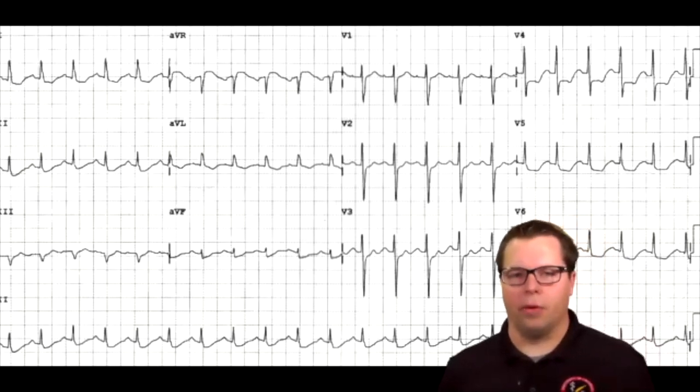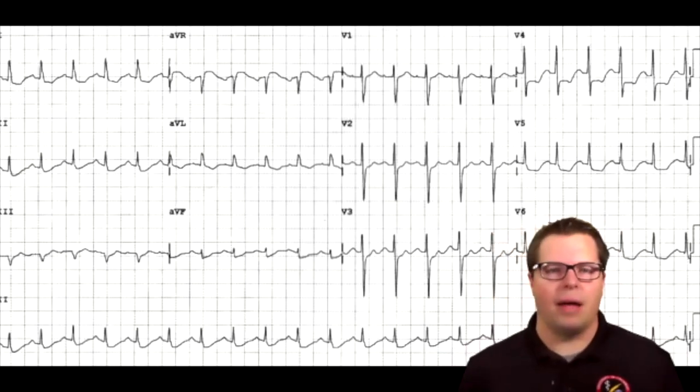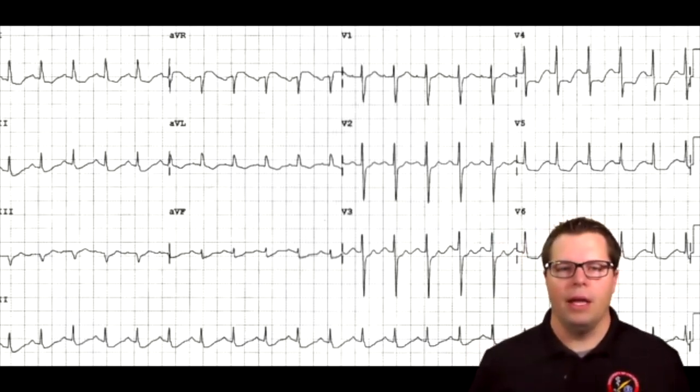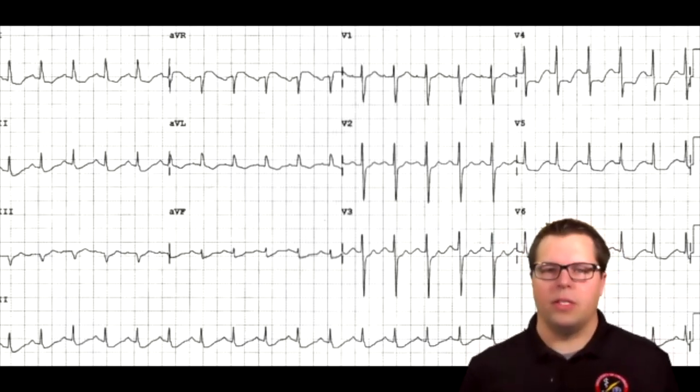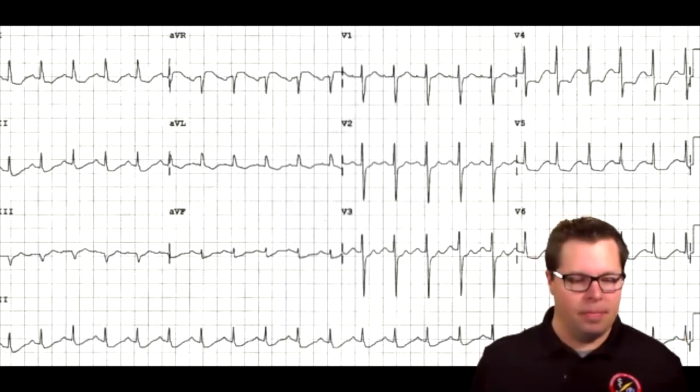Significant flat ST depression. Downsloping or flat ST depression is bad. It may not be a conclusive sign of exactly what's going on, but it's basically saying the heart's under stress and not getting as much blood flow as it needs.